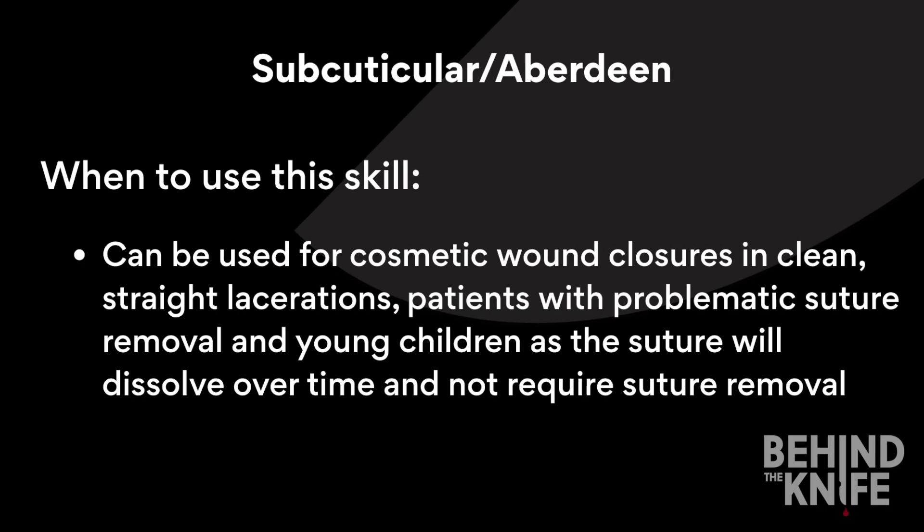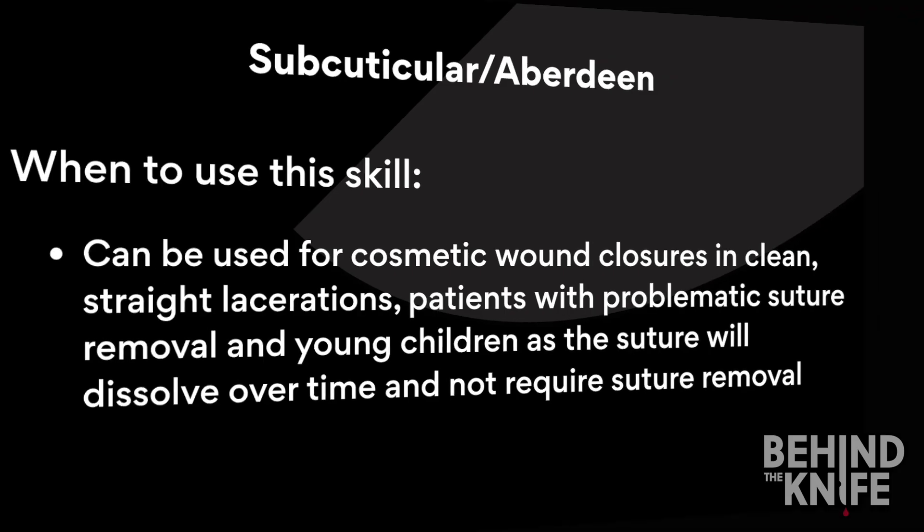The subcuticular running suture can be used for cosmetic wound closures in clean straight lacerations, patients with problematic suture removal, and young children as the suture will dissolve over time and not require removal.